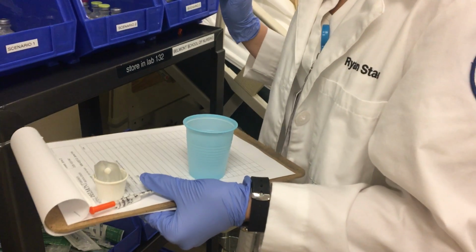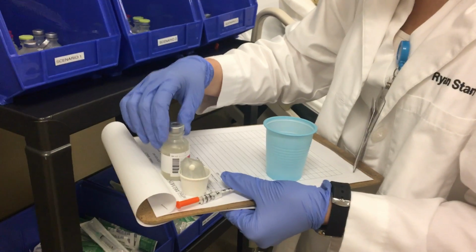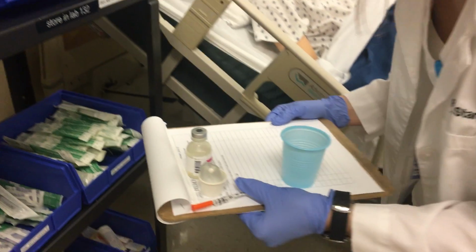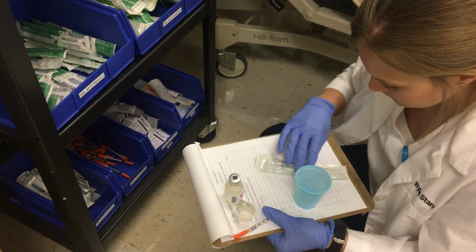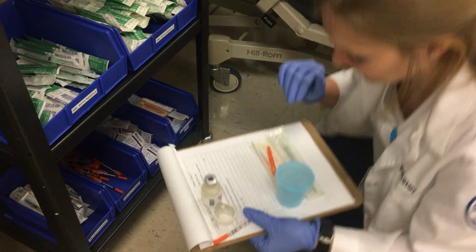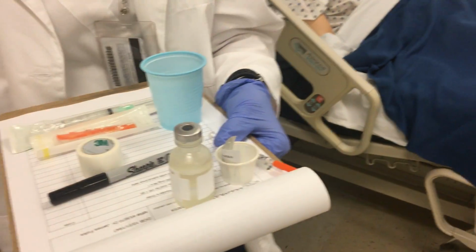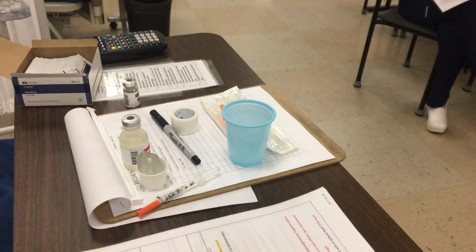And then for vitamin B12, it is 1,000 mcgs per milliliter, and I need 1,000 mcgs. So I'm going to grab my 3 milliliter syringe, and it is IM, so I'm going to use a 1.5 inch needle. I'm going to grab this. I'm going to change out my gloves.